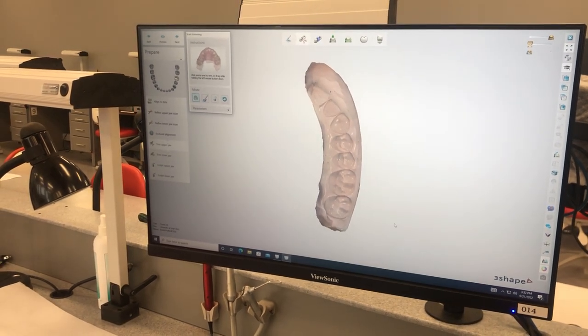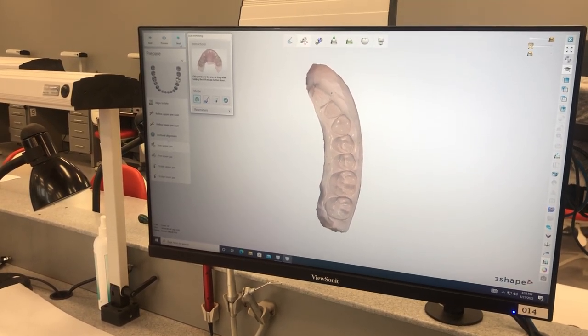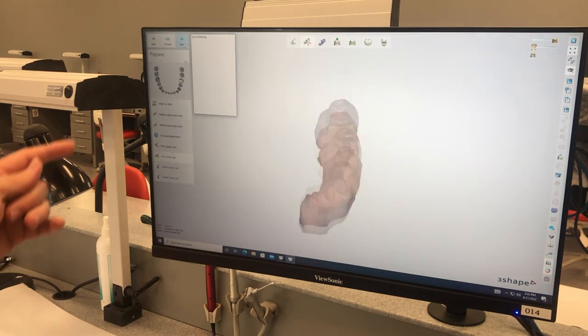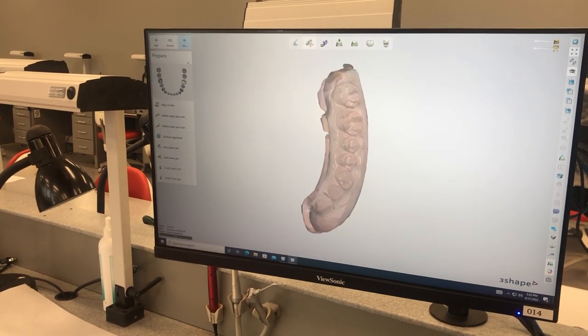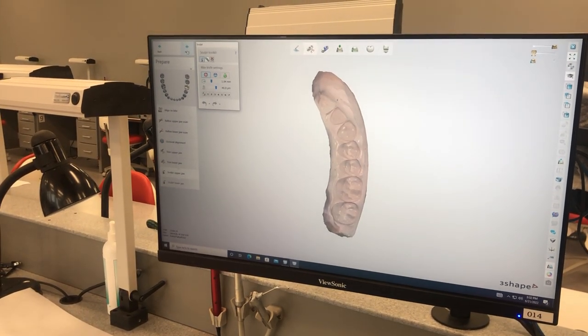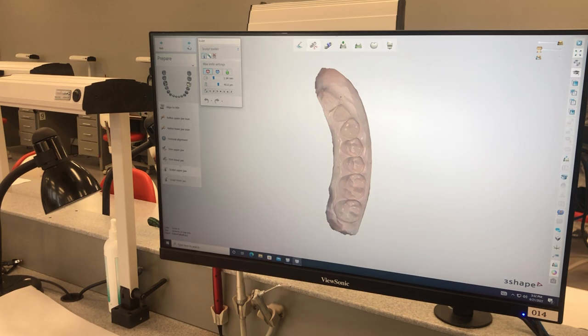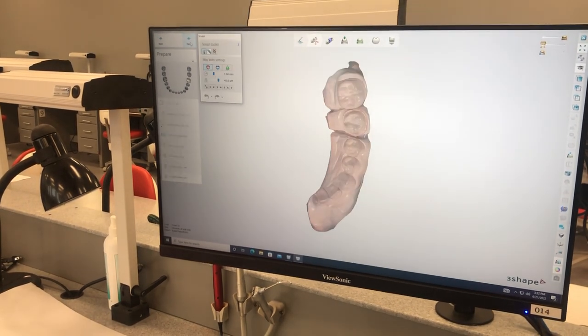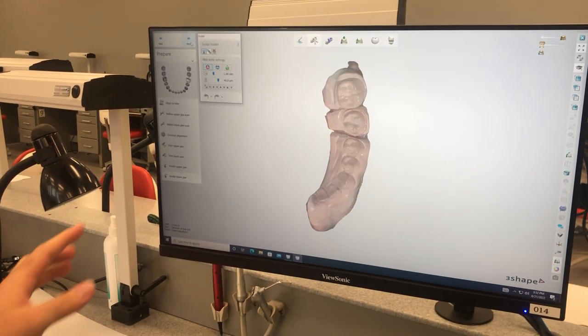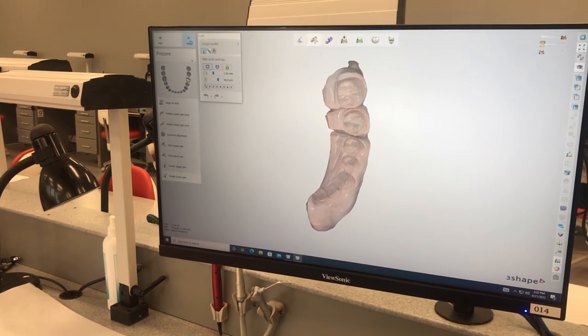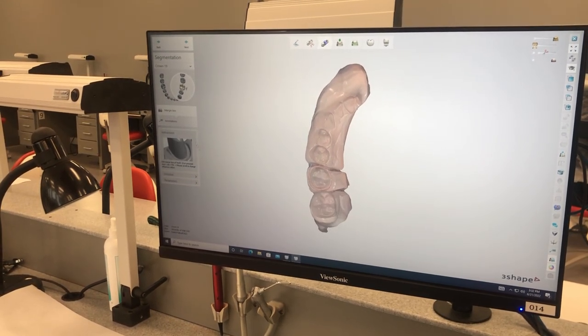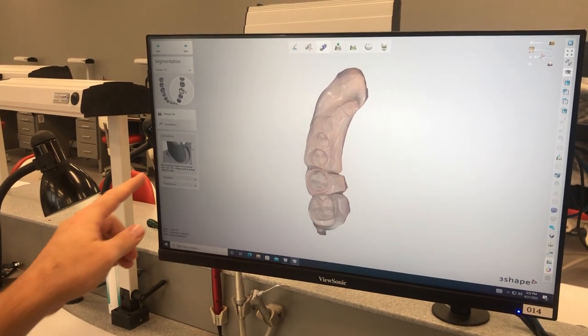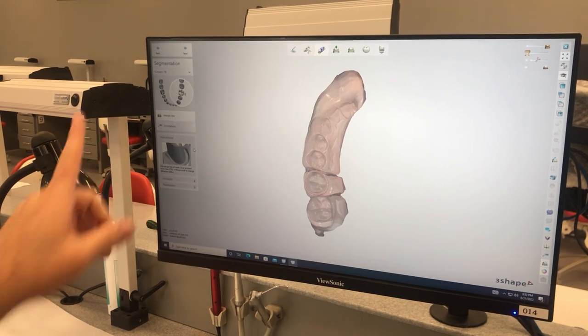If you ever get lost in the system, it's always telling you what you're doing over here. So just real quick, I'm not going to go through all the details, but like it says trim upper jaw, we've already kind of refined it so we don't need to do that. Trim lower. If we wanted to add something or take a tooth off because we were making an Essex retainer or a pontic of some sort, we could sculpt and we could remove teeth, but we're not necessarily doing that right now. Now it's talking about our margin line. It's always going to tell you what you're doing over here. We just follow the instructions in that other video.